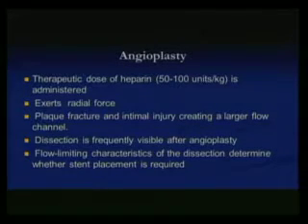So coming to the angioplasty, you have got the access, you cross the lesion with your wires and support catheters. Before any angioplasty, you have to make sure the patient is fully anticoagulated. I usually use 100 units per kilogram of heparin. If I suspect this is going to be a long case, I usually have an ACT machine available. I usually check my ACTs also.